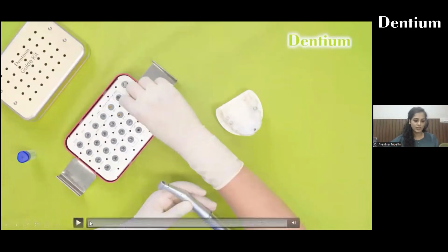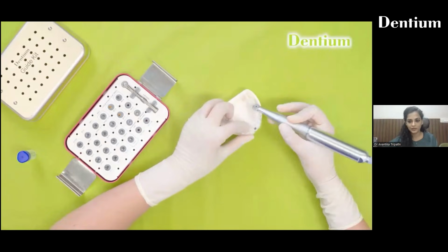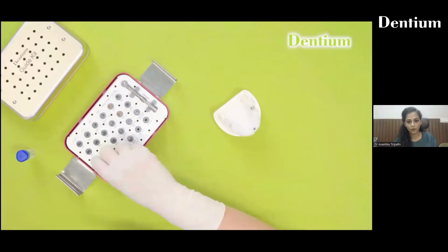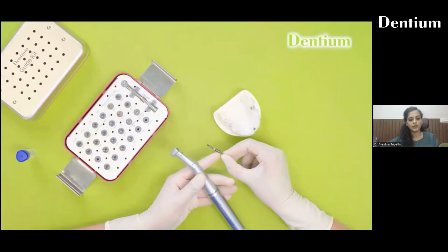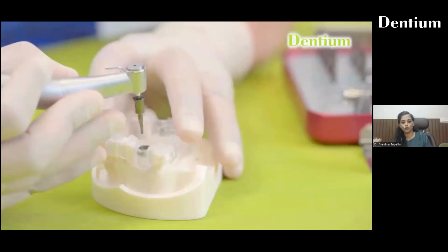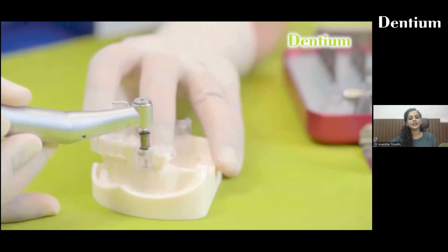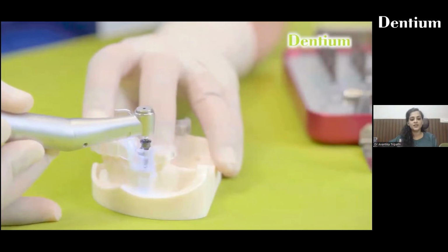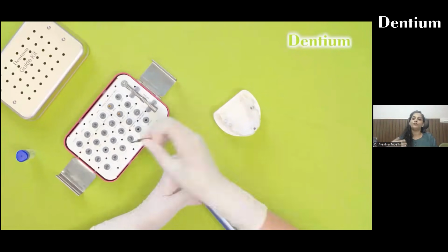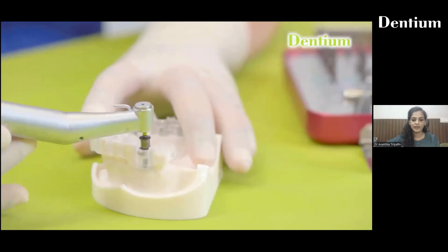Coming to the drilling sequence. First, we are going to insert the flat drill, which is going to flatten the irregular crest. It is going to create a stable platform. Then we are going to increase the diameter of the drills, guide drill, 3.6, 4, 4.5, whatever is the final diameter of my implant which is planned, till the same length. So the initial drill has to be 6 mm. Then we are going to use the guide drill of 8, 10 or 12 mm.